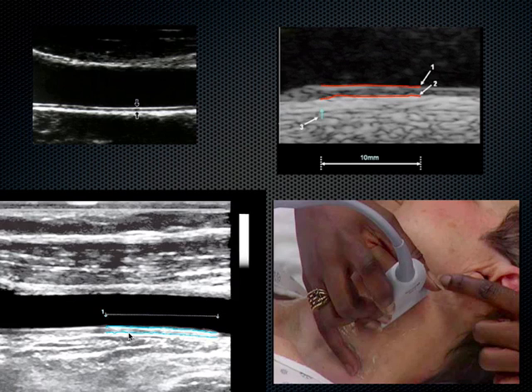But if you took it to a patient who was much older or had a lot of known coronary heart disease, you could see this thicken quite a bit, actually. So something to think about, this carotid artery measurement. Here we are with the transducer in a longitudinal plane.